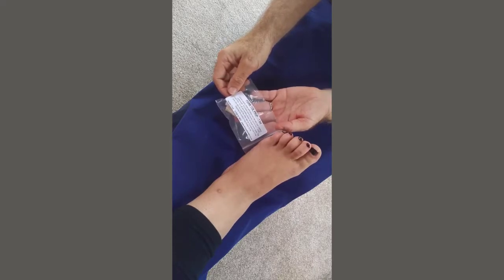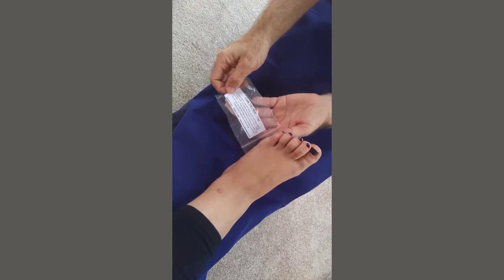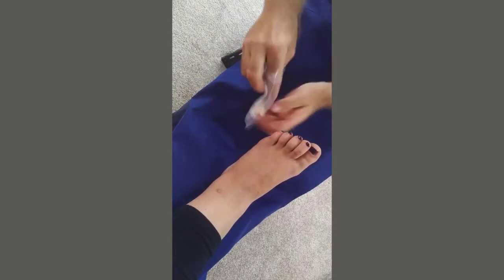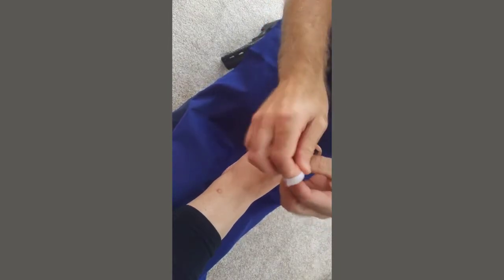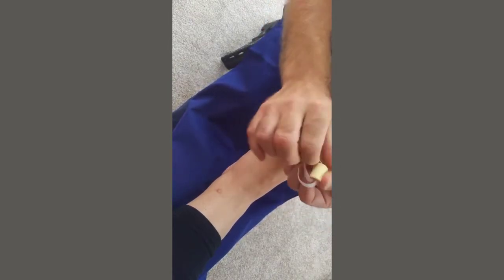The prop can also be used the other way up to protect the top of toes. Note that washing this product may shorten its life. Taking it out of the packet, you'll see it has an elasticated strap that stretches and comes through the device.